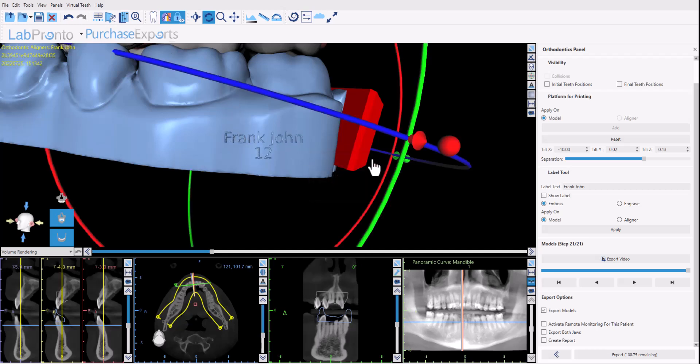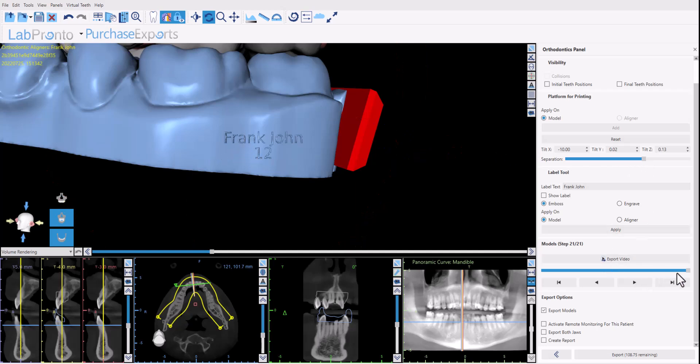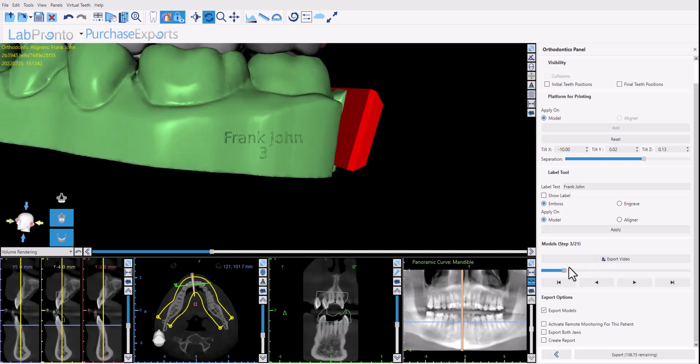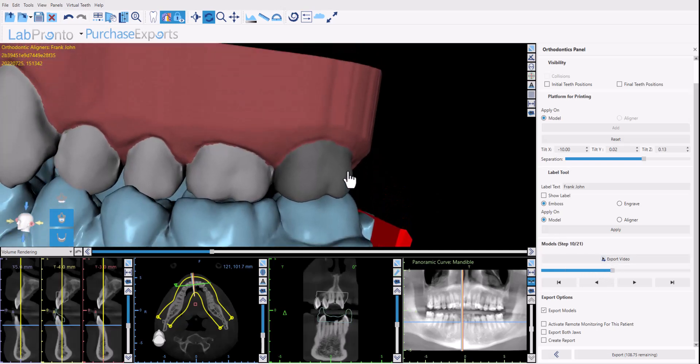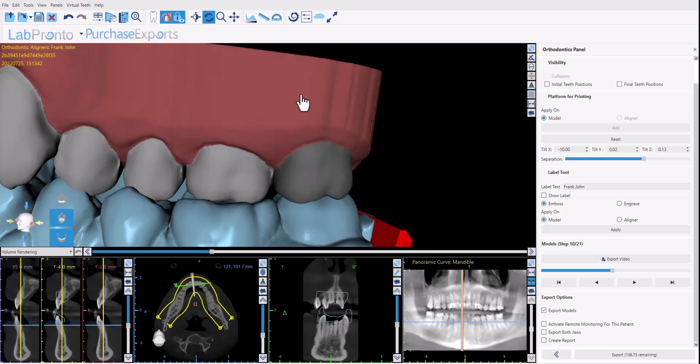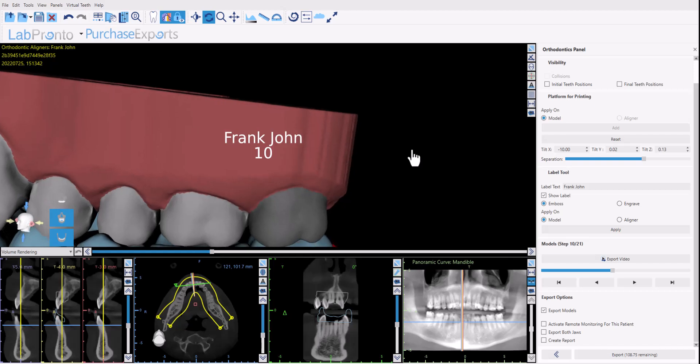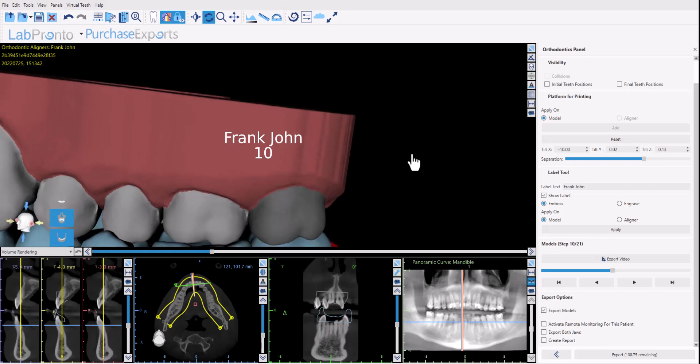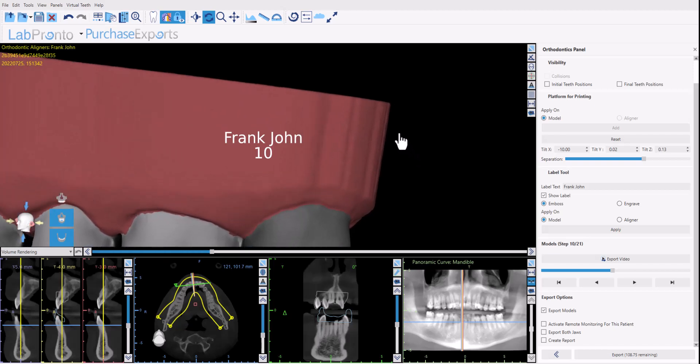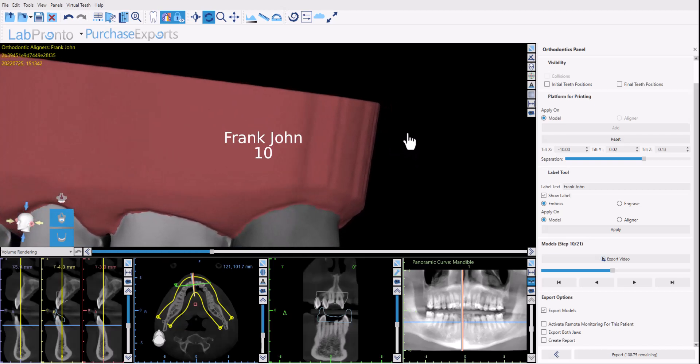Okay we could see the result here and if I go through the different stages we could see the numbering changing accordingly. We could repeat the process for the opposing arch as well. We could add the text and the numbering, position and click apply.